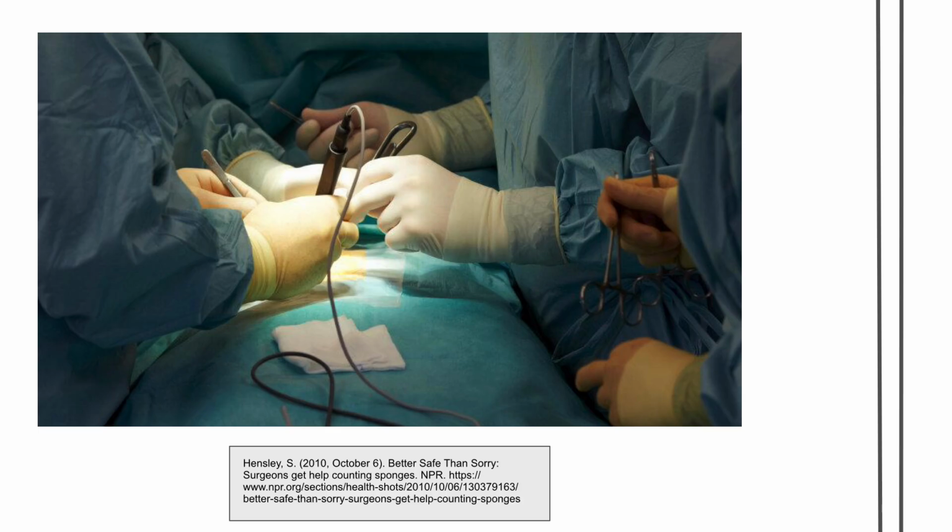Once the procedure is completed, the abdominal wall is closed. Before closure, the instrument and pad counts must be double-checked. The surgeon should manually inspect the peritoneum for any retained pads or instruments, even if the surgical technologist has found the count to be correct.